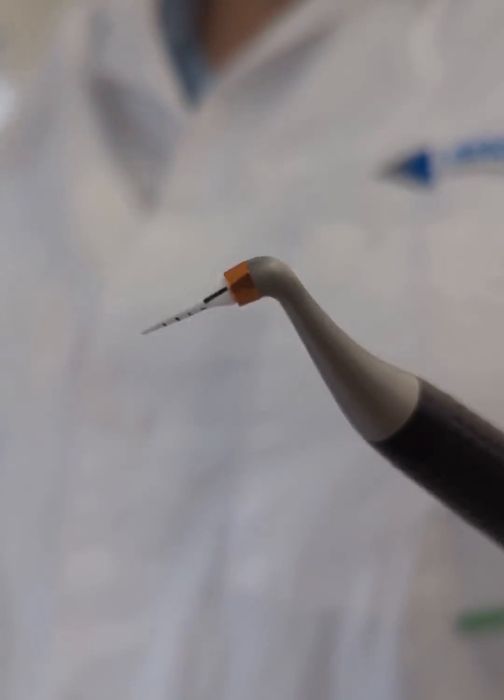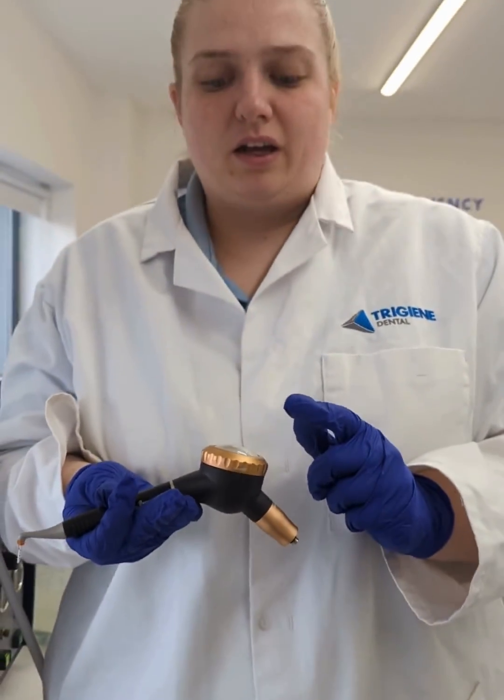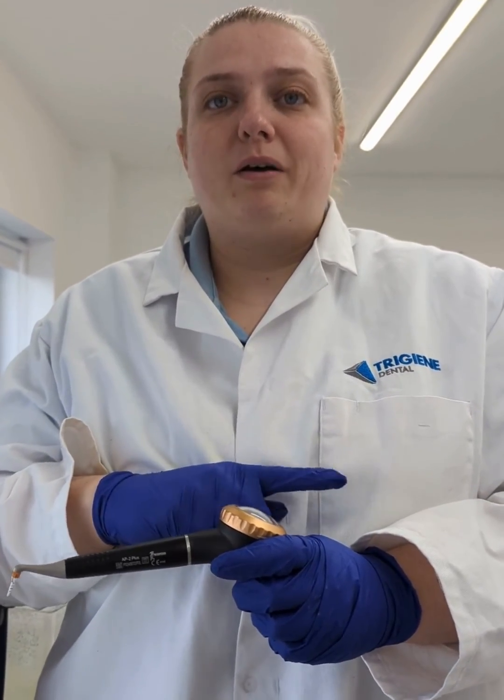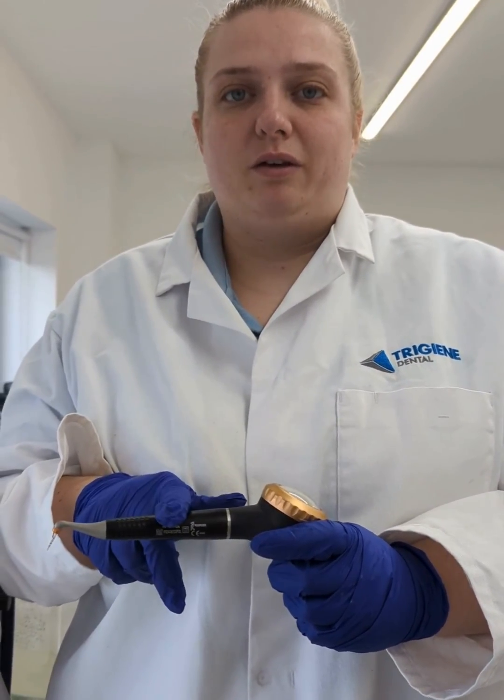So you do have to use sub-gingival perio powder to be able to use the handpiece. So make sure you take out the prophy powder and put the perio powder in before you do this.